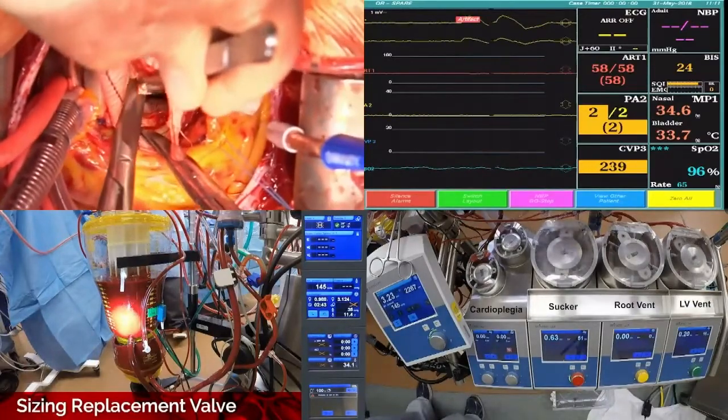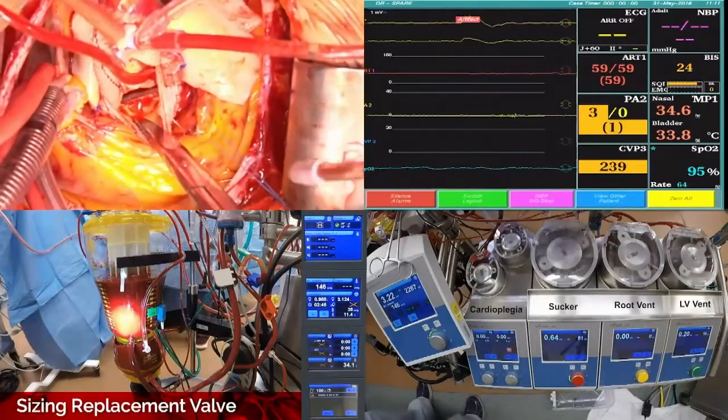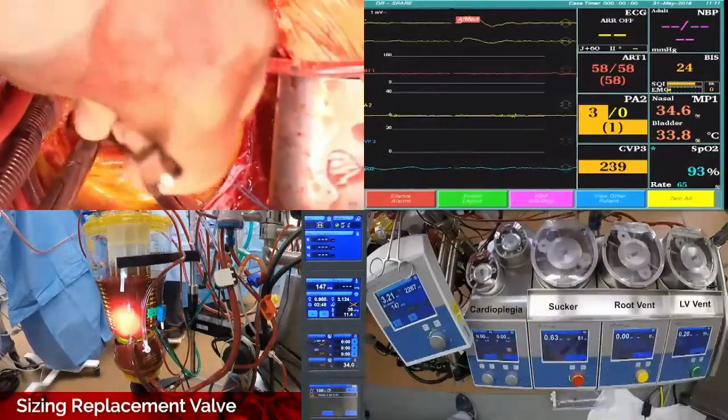Do you ever drop a piece of debris down into the ventricle? Yeah. So then we just suck it out? It happens occasionally, but if it's big enough, you see it. If there's any grainy stuff going in, I usually stop what I'm doing and use a debridement sucker, which is a little more focused suction to scrape all of it off, kind of like a big plastic Frazier sucker. One time I had an assistant in that little corner where you clamp and the aorta bends at the bottom. A chunk about the size of a fingernail had slipped down in there, and I didn't see it, but she saw it because she was looking up, which would have been a stroke.